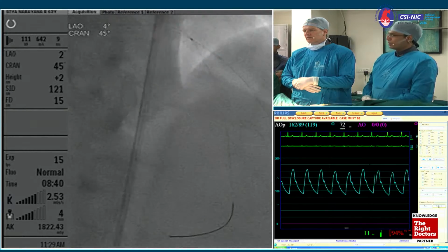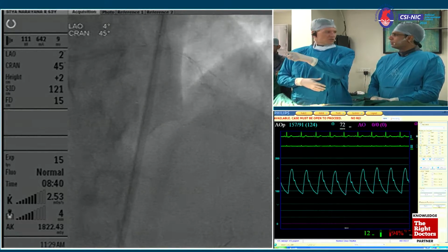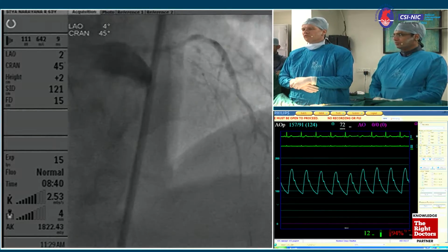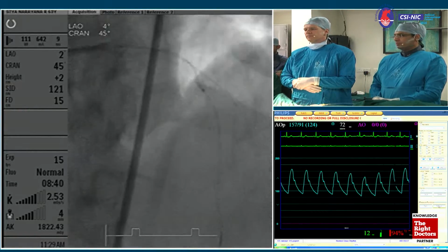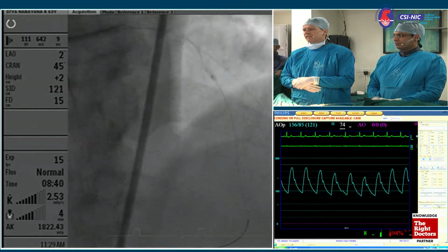Next. It was a 2 balloon. It was a, no, 2.5. And now, it was a 2.0? 2. Okay, now 1.5 crosses. Next, please. Patient has chest pain, which is expected. We are dilating several times.